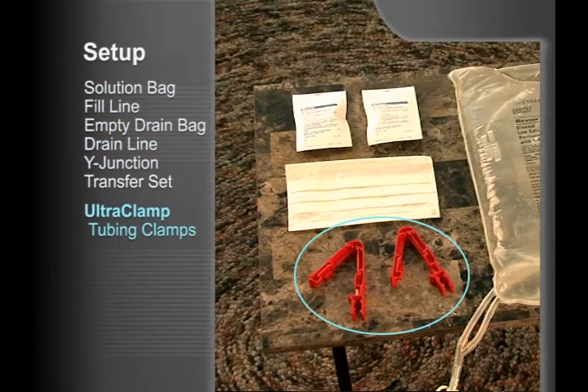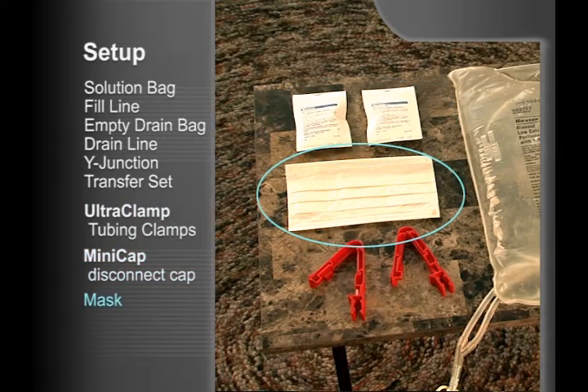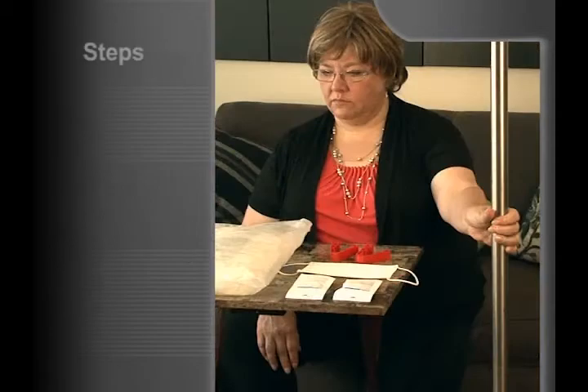You will also need two UltraClamp tubing clamps, a new MiniCap disconnect cap, and a mask. Your dialysis nurse may recommend having two MiniCap disconnect caps available during your exchange.